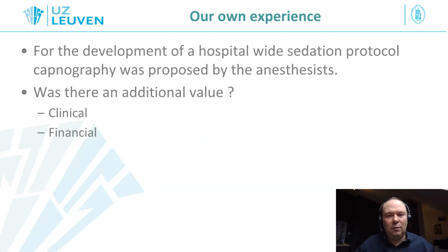So for the development of a hospital-wide sedation protocol, capnography was proposed by our anesthetist, but we wondered whether there was really an additional clinical value in terms of safety, because we did not have that perception at least, and we also wondered whether it was worth all the money spent on capnography for this.